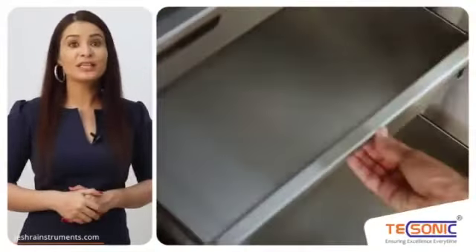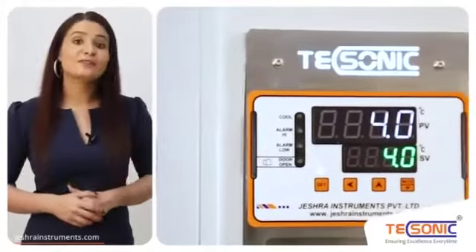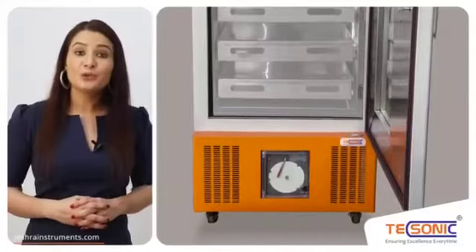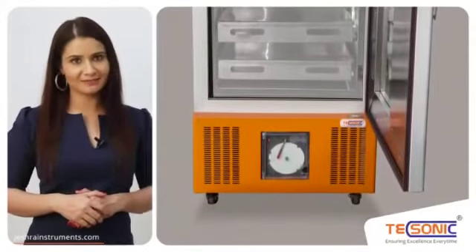It has heavy duty stainless steel 304 trays, displaying set and process value at the same time. Extra strength non-CFC refrigeration system. The unit is mounted on caster wheels for easy mobility. CFC free puff insulation to ensure temperature stability and safe power consumption.